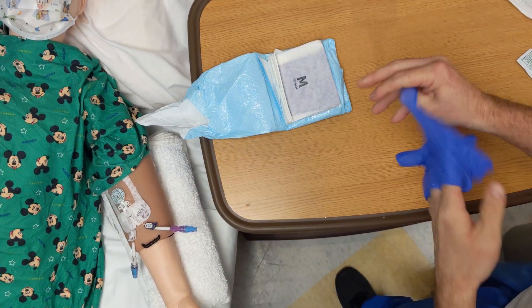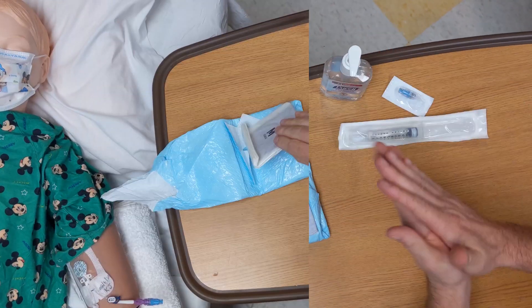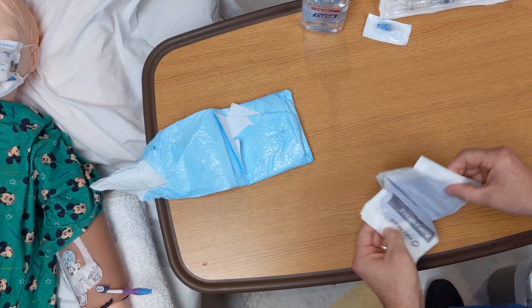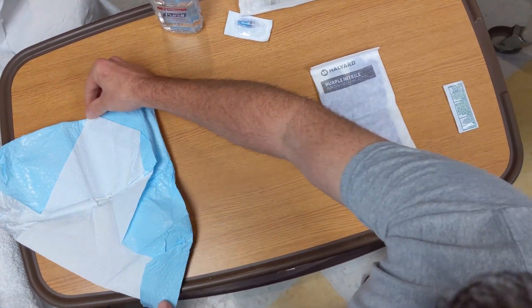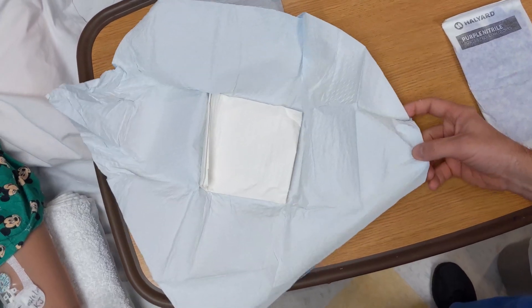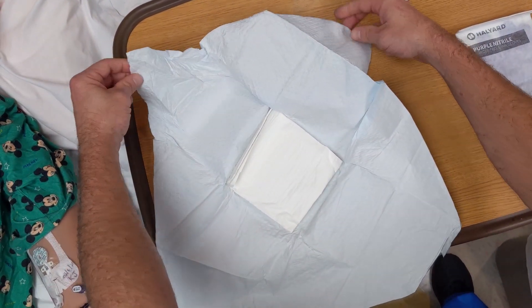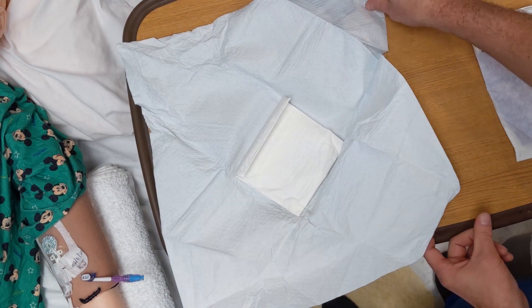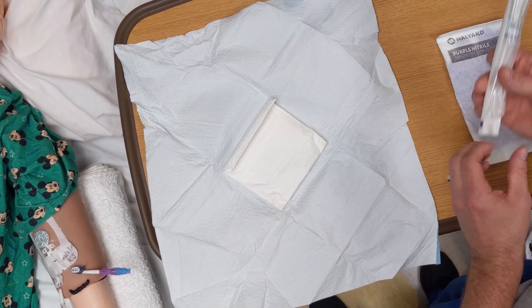Perform hand hygiene. Using aseptic technique, open the kit. Place the sterile normal saline flush and the additional caps on the sterile field.